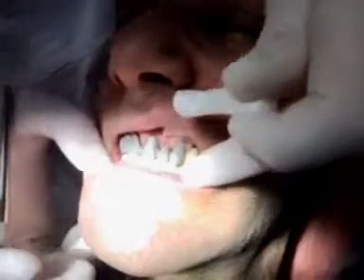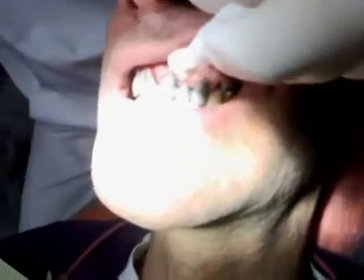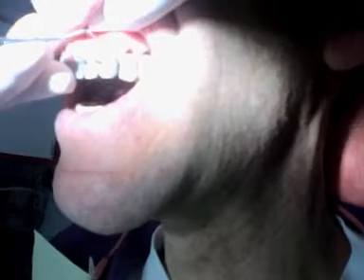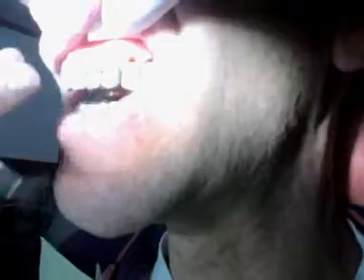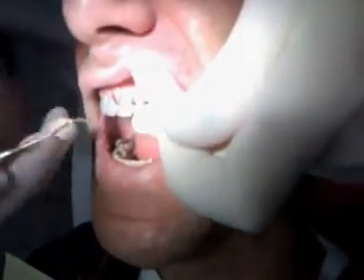The doctor says that everything is perfect at this point and we're going to be ready for taking an impression because we're going to re-articulate this case in the mouth. We have a shoulder there and that's exactly where it ends up. We haven't finished our margins on the metal yet, so they might be a little bit thick at this point, but the next stage of finishing the case will be very thin in that area.